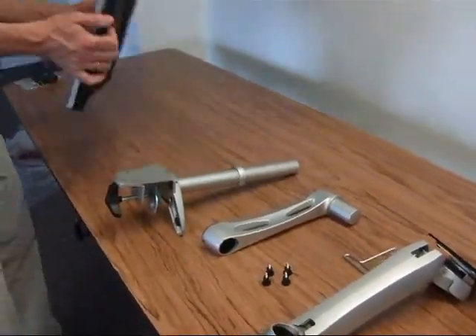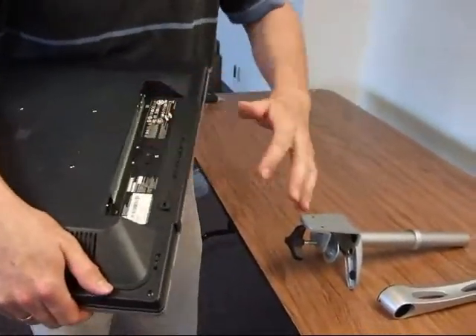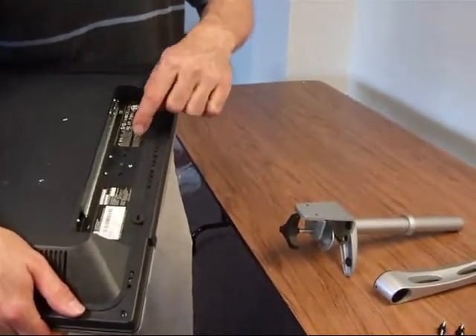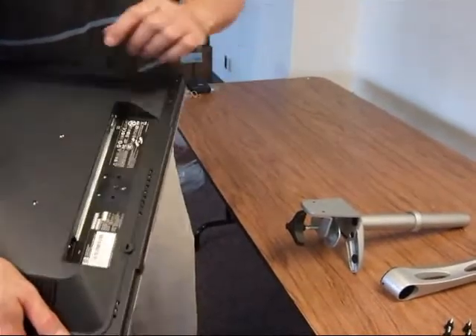Then we have the monitor. If you take a look at the monitor, most likely when you receive it from us the base is already taken off. If you need to take off the base, the actual hinge and the base of the monitor on the HPs — we have three little screws there that you access through the back.